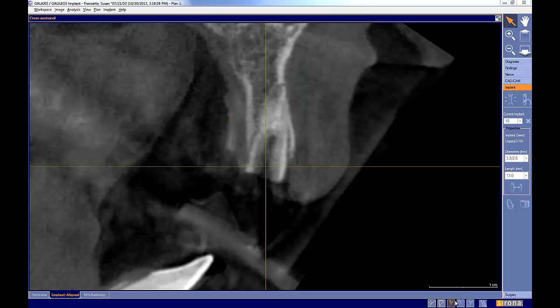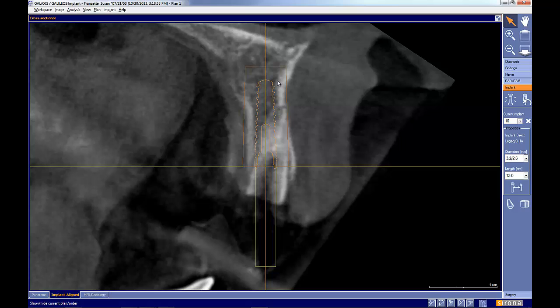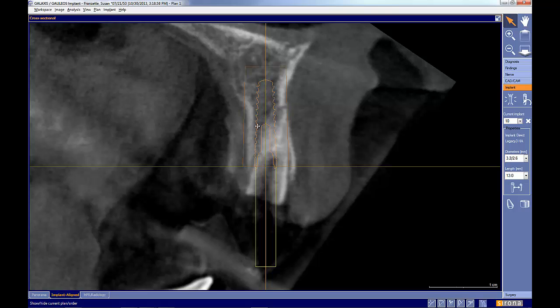So now let's go ahead and get our implant plan back on here. And here's our implant. So again, if we look back at our mental visual of where the bone is, it's right down here. So this implant plan is obviously way too high, it needs to be like that. Okay, that'll get us to the bone level. Now we know that we're going to have some bone loss from taking the tooth out. So I would probably go ahead and drop that a little bit more that way. And now we can see by doing that, a couple of things we've gained. Apical stability.